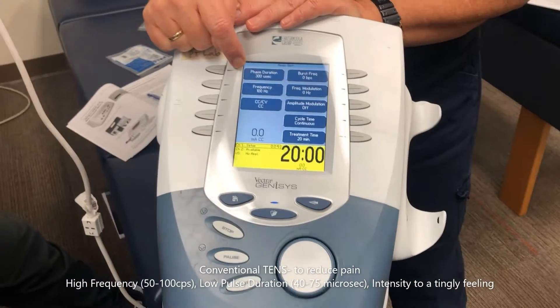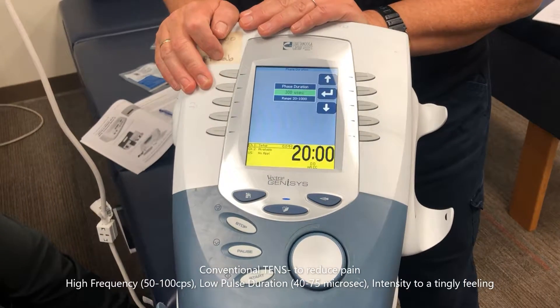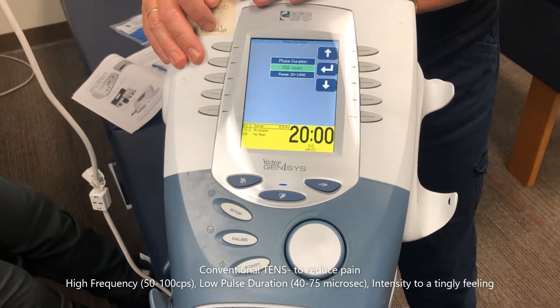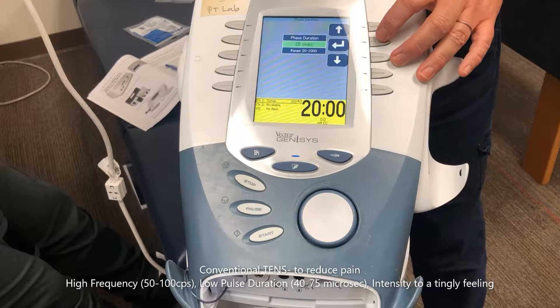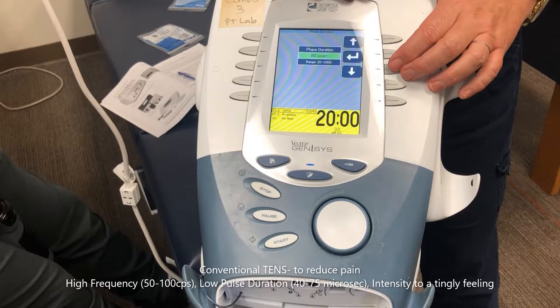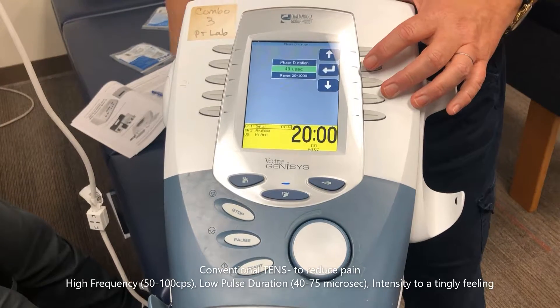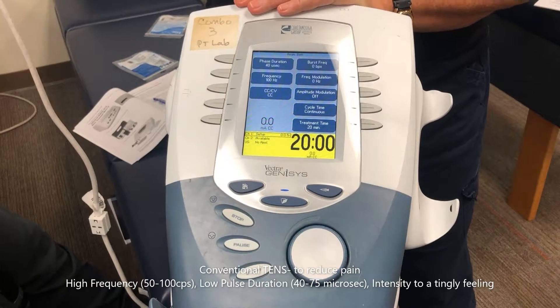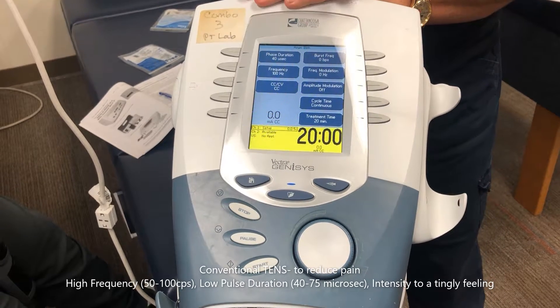We're going to change the phase duration to 300 microseconds — sounds like a long time. Our target range was 40 to 75 microseconds, so I need to bring it way down. I'll set it to 40 microseconds — that's how long the pulse is on. Pretty fast. No burst.